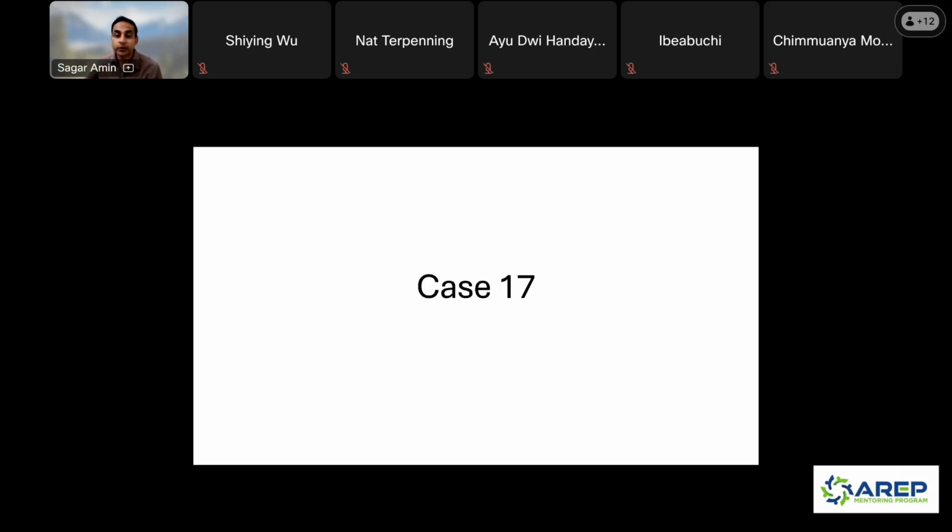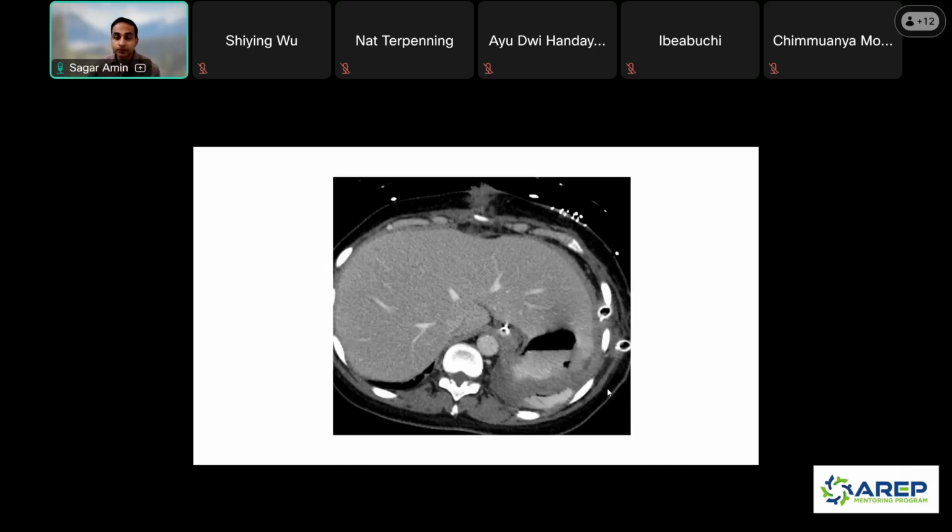All right, moving on to the next case. I think we have a couple more. So we do have, like I said, a lot of trauma at Grady. So this case is a good example of some trauma, some not trauma, but something to look at.